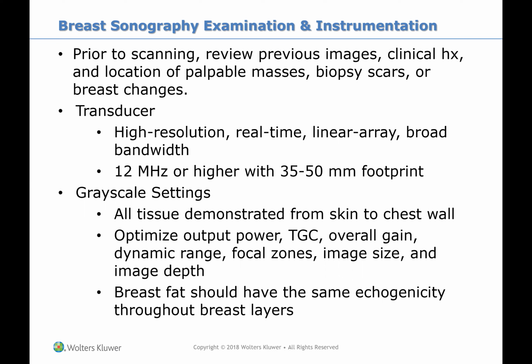With the transducer, you're going to use a high resolution real-time linear array, 12 megahertz or higher. So basically your small parts probe. And the grayscale settings, all tissues should be demonstrated from the skin to the chest wall. Breast fat should have the same echogenicity throughout the breast layers. So make sure your TGCs are correct.